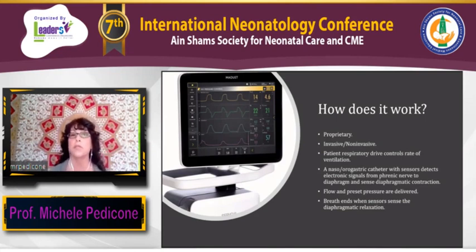So the patient's respiratory drive controls the rate and the depth of the ventilation. Basically the patient is setting their own rate, tidal volume, and inspiratory time. So think about how synchronous this is. A nasal or orogastric catheter with sensors is inserted into the esophagus to the level of the diaphragm and senses this excitation. Then a flow and a preset pressure are delivered, and the breath ends when the sensors sense that diaphragmatic relaxation has occurred.